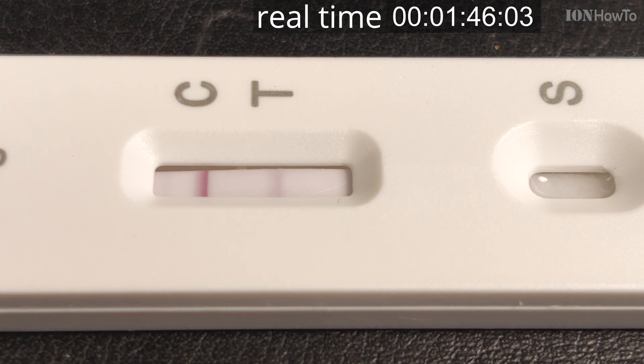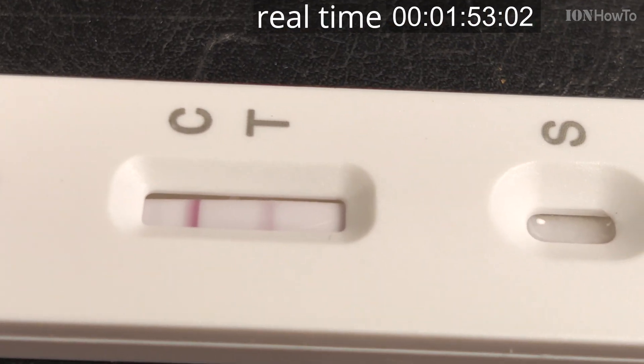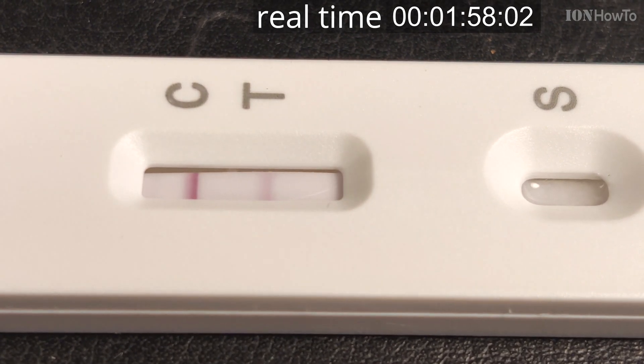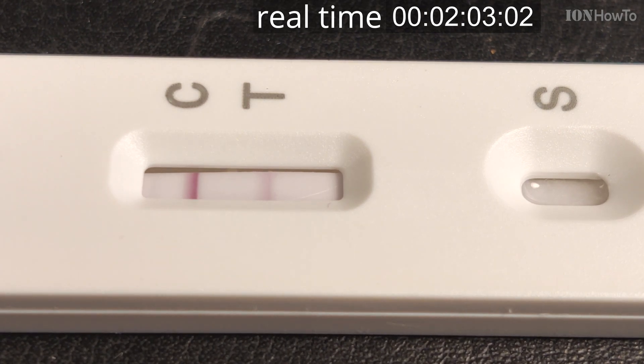This sample was taken after cleaning the nose with saline solution. You might think that clearing your nose could make the test not show positive, but the sample of the virus is still there. This SARS-CoV-2 COVID-19 rapid test is not considered very sensitive, but it was sensitive enough to catch the virus even after washing the nose.